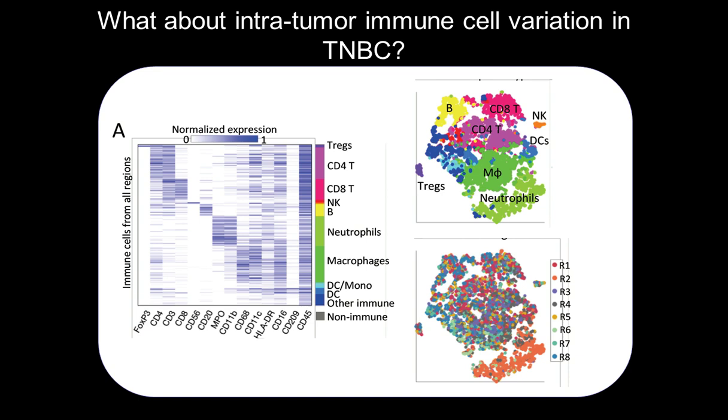And so this raises an interesting point: even though the composition of the tumor was phenotypically variable, how the immune system was coming in and interacting with the tumor at all those different points was quite conserved. I think it bodes well for undersampling tumors for studying tumor immune interaction, but it also reinforces the fact that if you want to study tumor heterogeneity itself, you have to sample much larger areas.